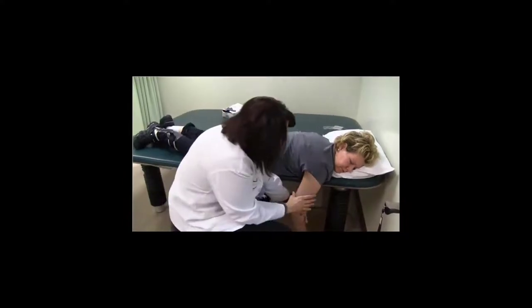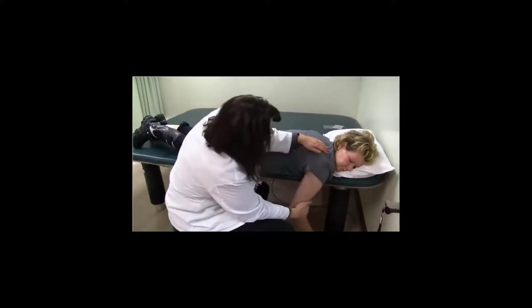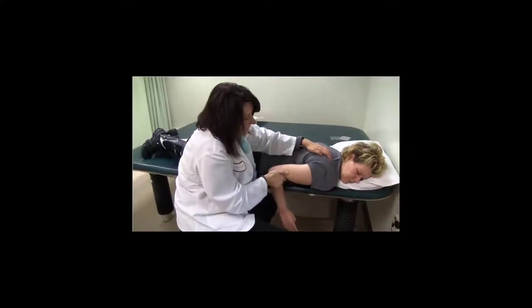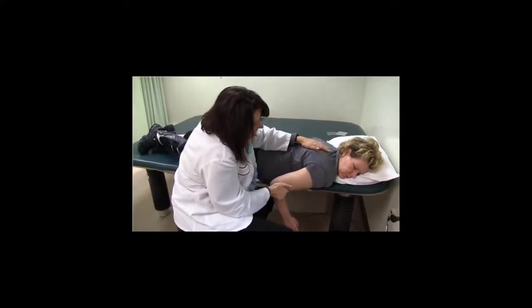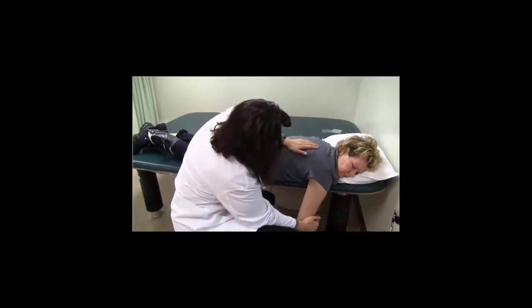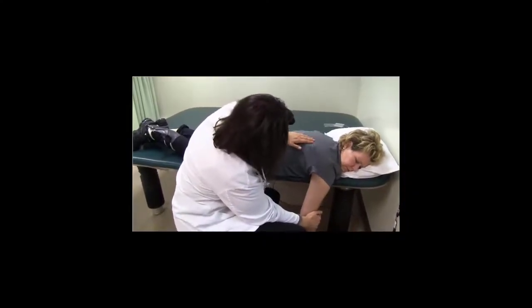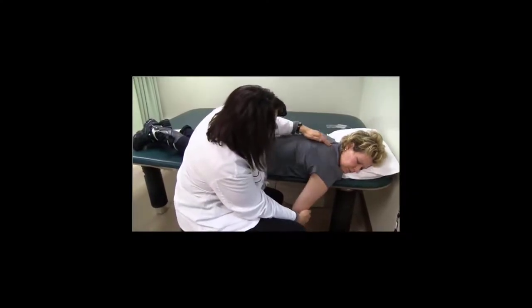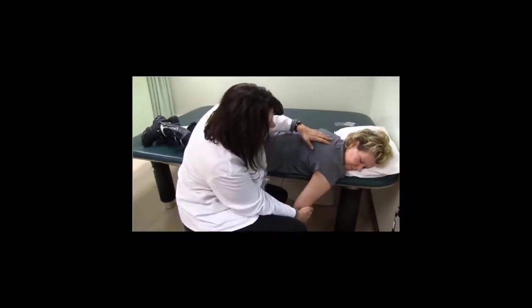Okay. All right, Britta, what we're going to do is you're going to start with your arm in this position here. When you feel the stim, I want you to pull your shoulder blade up and back and pull your arm up to your body. When the stim turns off, you're going to let your arm come back down. I'm looking for you to access these muscles right here where the electrodes are. Okay. I'm going to wait for your cue. I'm going to guide you through it too. So when you feel stim, I want you to initiate the movement.